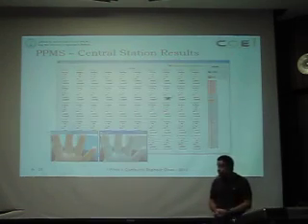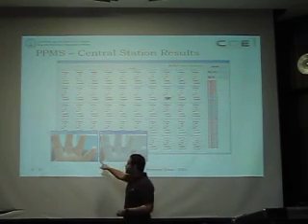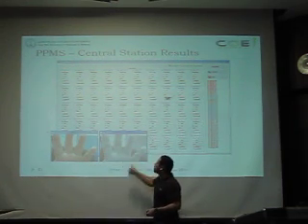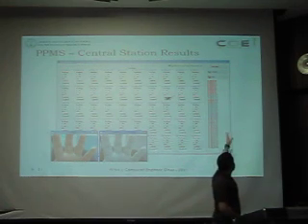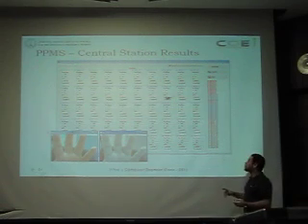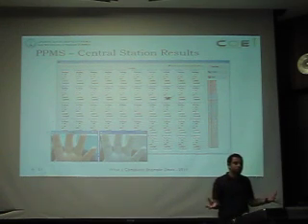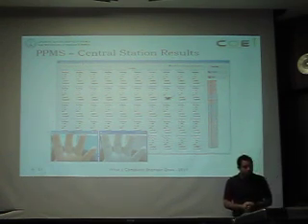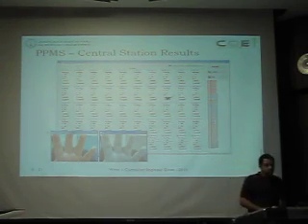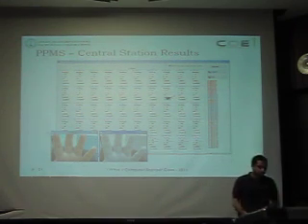The central station, these are snapshots of the central station. As you can see here, this is a webcam stream from the patient's room to the central station. And we have the list of patients here. So you can choose any patient and then click on camera to start the webcam streaming. And then we can send a note, of course, to any patient from the list, so that it can be received at the central station, and then the central station can take action, of course.